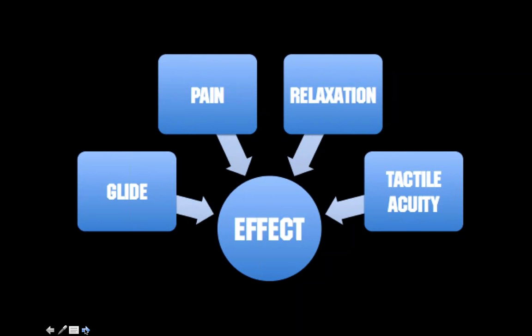And then if you truly want to go hard into tissue, trying to increase this glide effect because you feel through your assessment that the tissue does lack glide, then you could go into more of a mechanical theory of increasing sliding glide. And we do that with actually a dry technique.